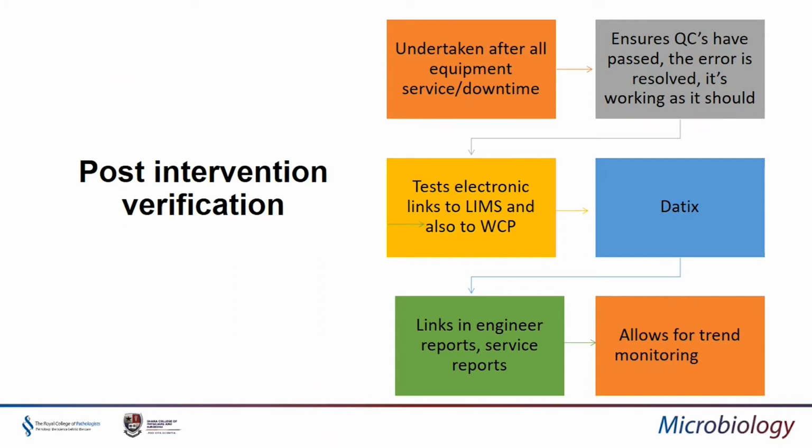And by doing this, it allows us to do a full DATIX report for all of Public Health Wales. So everyone that has the same instrument may be having the same problems. And then this could be something that we can contact the manufacturer and discuss, what can we do to stop it from happening, or maybe get reimbursed for the tests that we've lost. So it's a really good way to monitor the trends in this area.